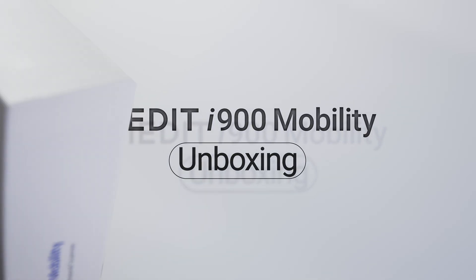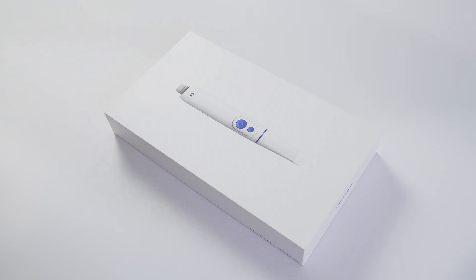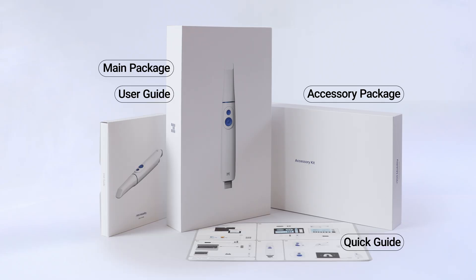Ready to scan with our new wire-free handpiece? Let's unbox the i900 Mobility together. The i900 Mobility includes the main and accessory packages along with the user guide and a quick guide.